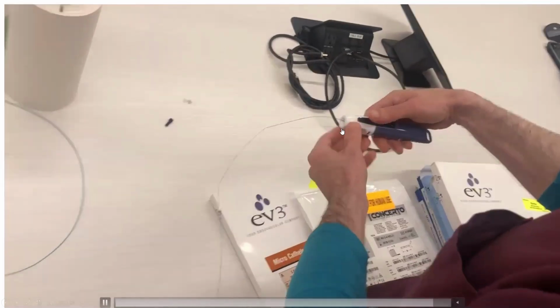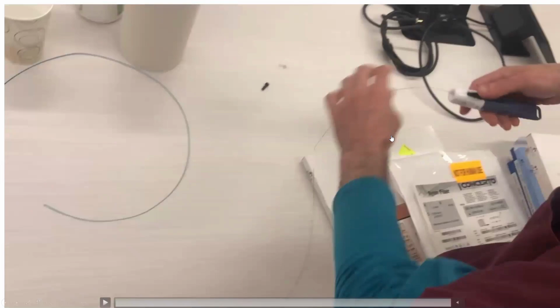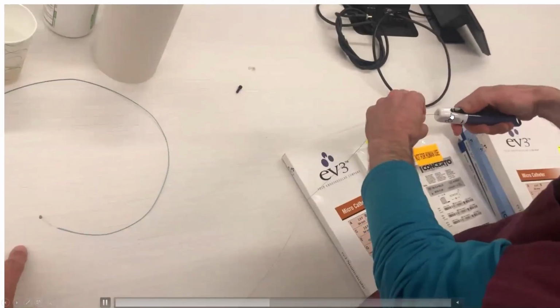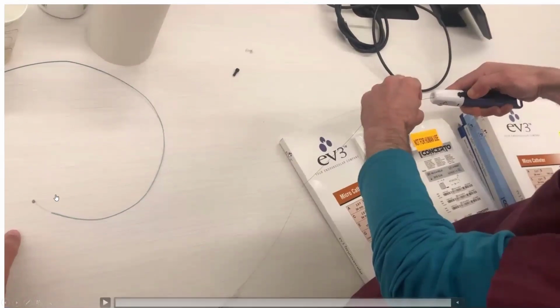You just push the wire into the wand, no clicking. Then after you put the back end of the wire into the wand, you pull backward on the black button, and the coils will get detached from the wire. You pull backward here on the black button, and the coils will get detached.